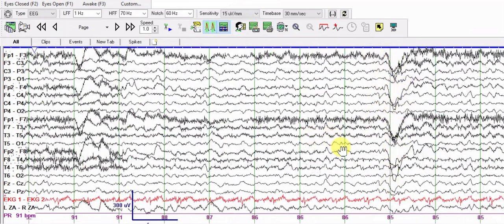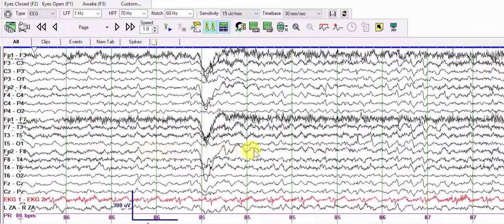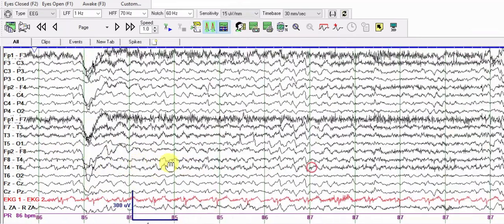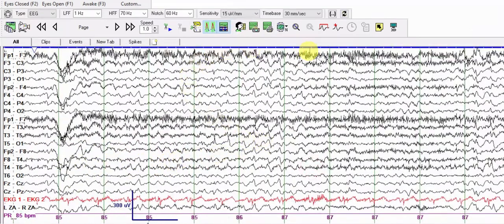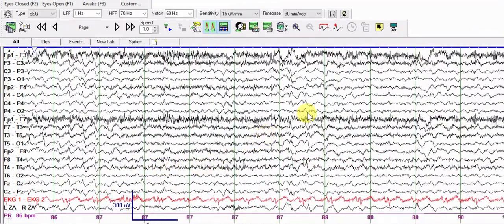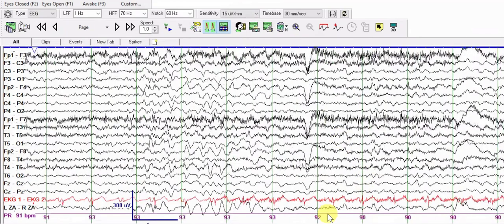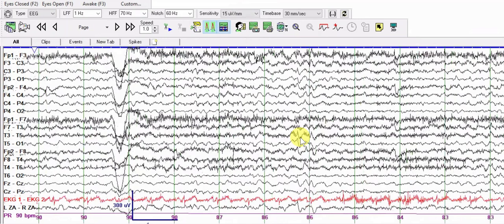This is an eye closure artifact. You're looking at very high amplitude Delta and Theta activity, with some sharp discharges mixed into the background. The heart rate is still 90 beats per minute. Delta is a little more prominent than the Theta activity, and this is again an eye closure artifact.